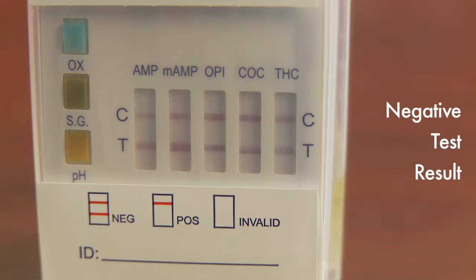Negative results for the StatCup specimen will appear as 2 lines in the testing window, one in the control region and one in the test region. Any line appearing in the test region, regardless of color intensity, should be interpreted as a negative result.